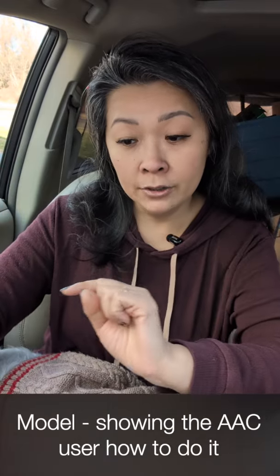An example would be Cheetos. She would have to tap on the word Cheetos, and then I would give her a Cheetos. And I would also model, meaning repeat on the device, Cheetos. Just really try to flood that language. Anytime she would hit that button, I would give her a Cheetos. At some point after learning that word, either it's the 10th drill or maybe a week in, you try to introduce something else so that they can learn to contrast and realize these words, these buttons have associations to them. There's an actual cause and effect to them.